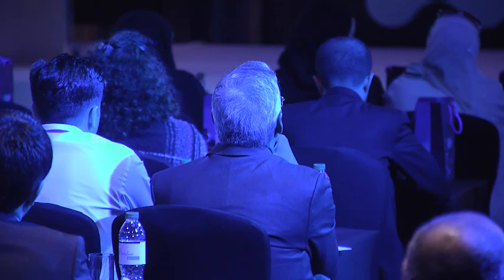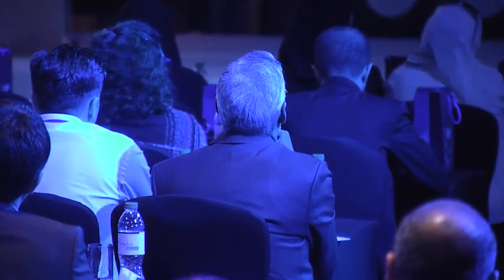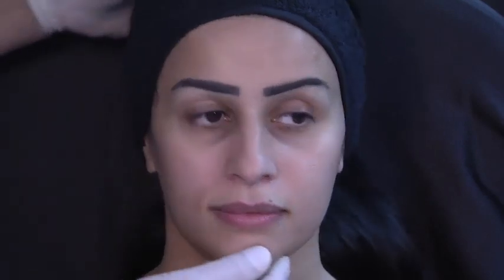We have just one question before we move on. Go ahead. Can we use cannula for the tear trough? Yes, we can, and definitely you're going to see 3 or 4 cases today of cannula. This is one of them. We have a new patient, as you can see, okay?